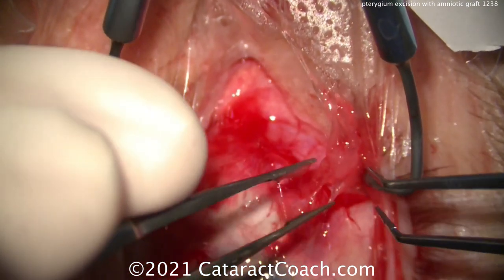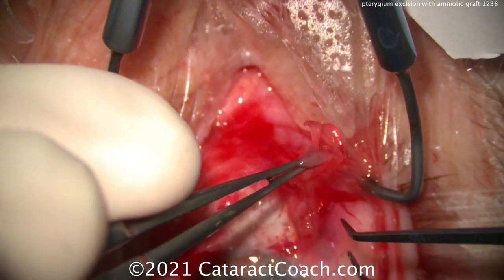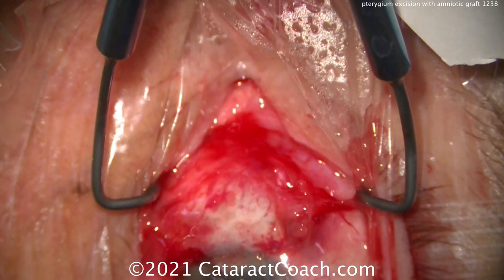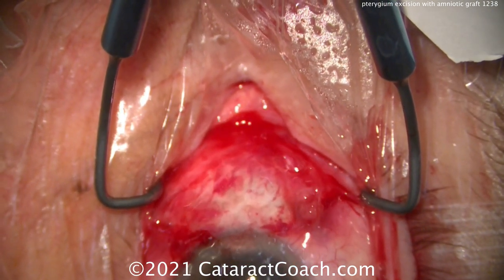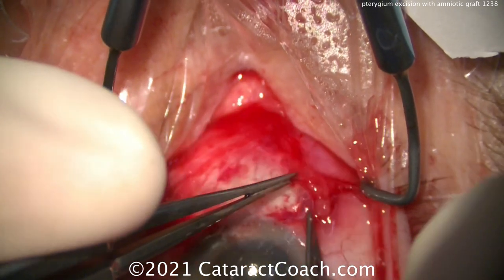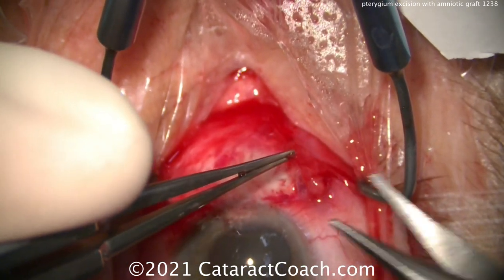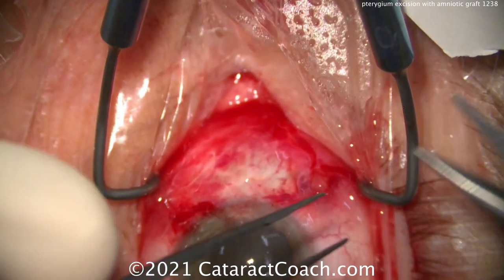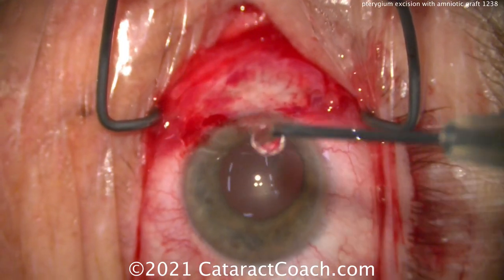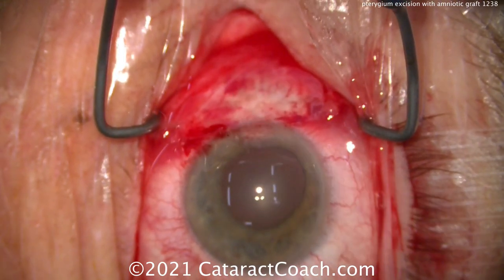Here's just a little bit of clumped glue, maybe a little bit of the graft — the excess part — or maybe it was kind of tight. We'll just trim that off — we want it gone, we want this nice and smooth. Again, pushing that underneath there. If you need to trim off pieces like that, do so — just get it nice and smooth so you have a good result. Happy to say the patient had a beautiful outcome from this surgery.